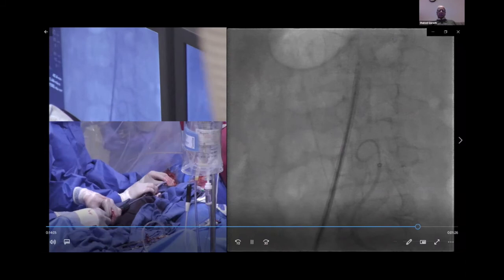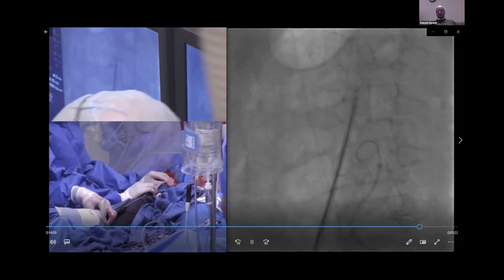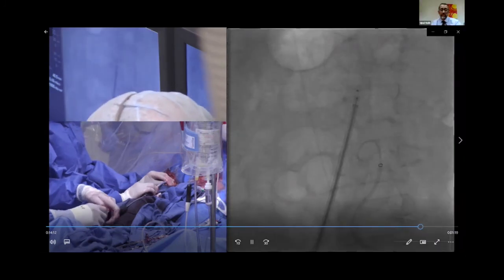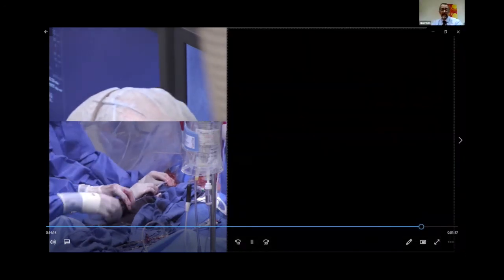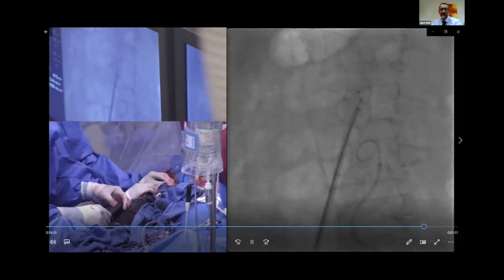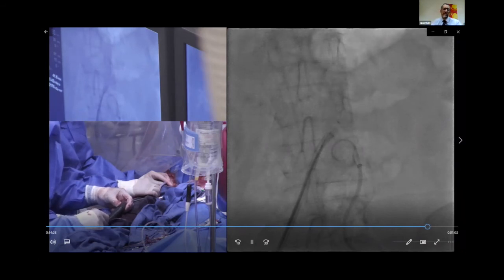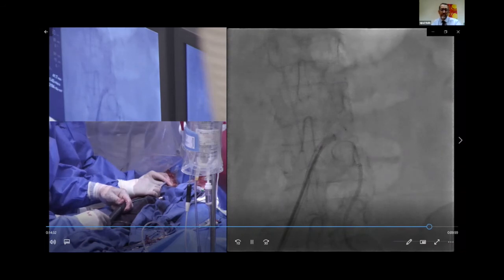And with all the calcium and disease that's diffuse, no cerebral protection? So we don't have it routinely. And actually, to be honest, until there is absolute data, you are putting another puncture in. You are putting devices up into two of the head and neck vessels, but not the third for some reason. And so once we get an umbrella type device, which they are coming on the market, which don't do an additional puncture, and which actually protect all the head and neck vessels, I'll be much more in tune.